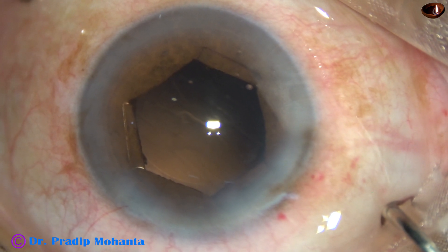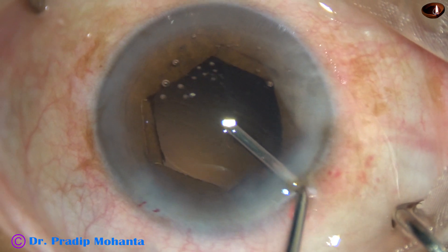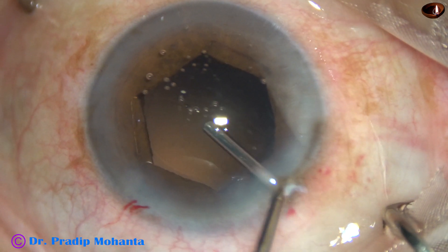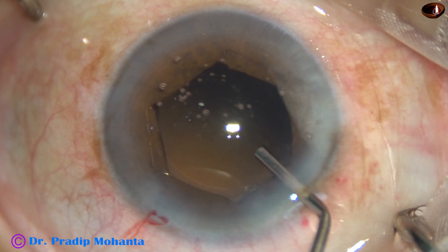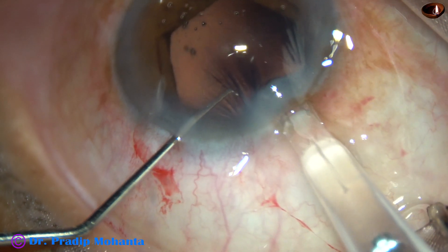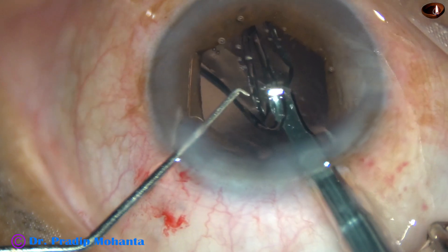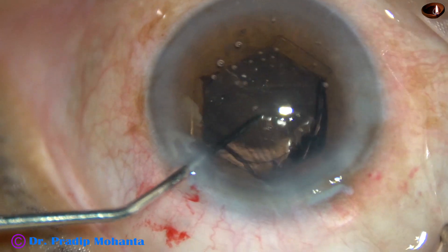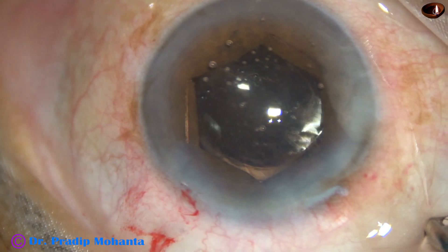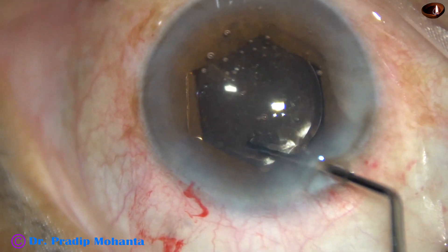Viscoelastic — that is 2% HPMC — is injected in the capsular bag and anterior chamber. A hydrophilic monofocal single-piece intraocular lens is implanted in the capsular bag. The trailing haptic is pushed beyond the flange on the iris and it moves into the capsular bag. I can see the rhexis margins here and the lens is in the capsular bag.